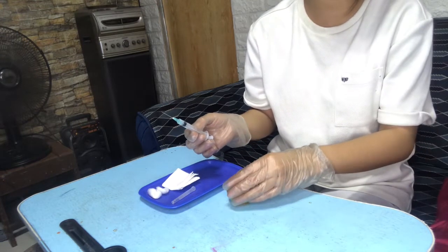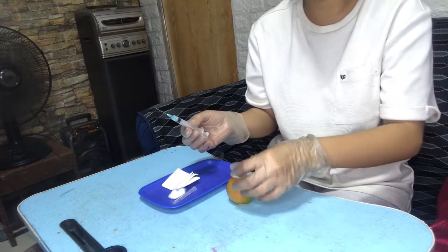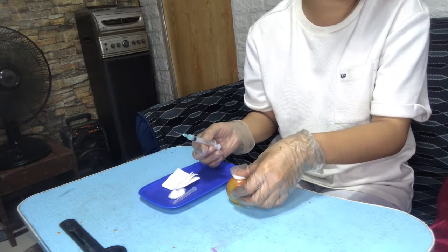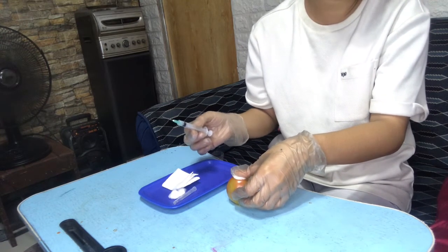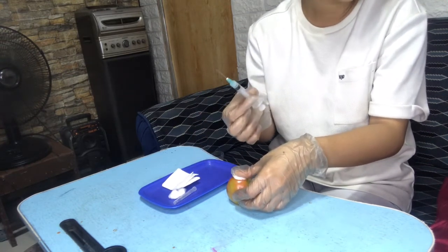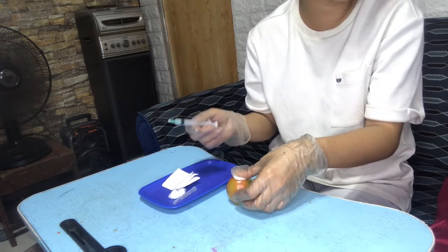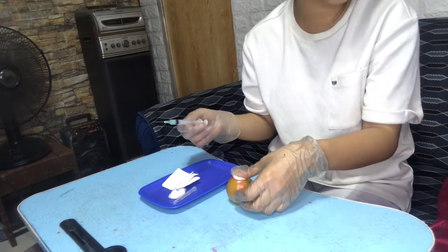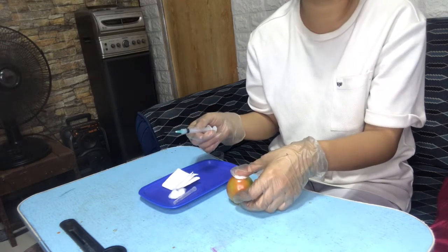Apply gentle pressure at the site with the cotton. It is not necessary to massage the area at the site of injection. If bleeding occurs, apply pressure with dry sterile gauze until it stops. For this syringe, we're going to dispose of it in the sharps trash. Next, remove and discard gloves and perform hand hygiene.